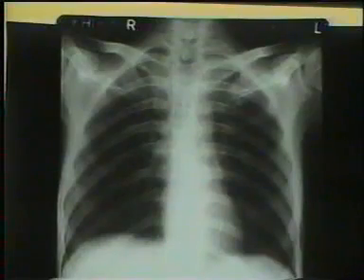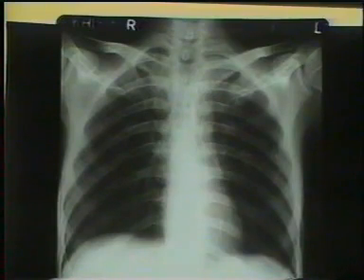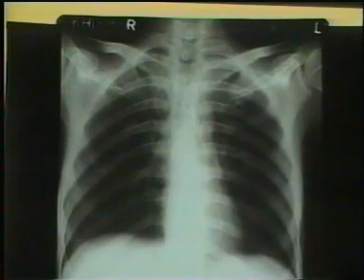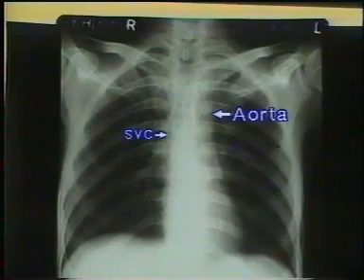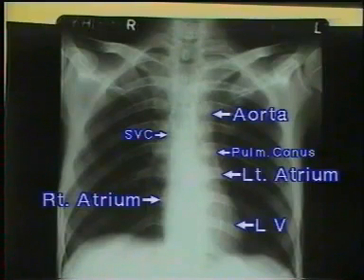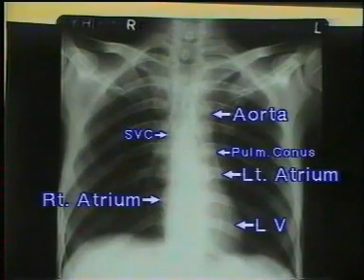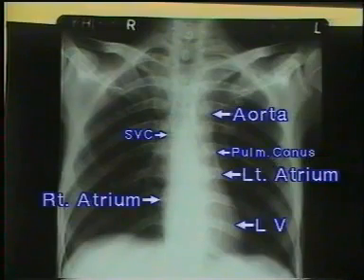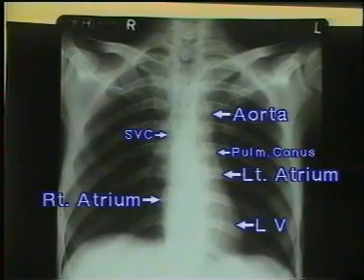Now inspect the cardiac silhouette. First study the cardiac border and measure the cardiothoracic ratio for cardiac enlargement. The left cardiac border is made of the aorta, pulmonary conus, left atrial appendage and the left ventricle. The right cardiac border is composed of the superior vena cava and the right atrium. We will study the details later.